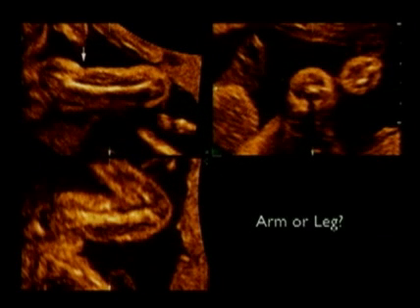Sometimes it's confusing to know whether the limb is an arm or a leg, but if you look carefully, you can see not only the features such as the elbow, the shoulder, and the chest, sometimes the ribs. There's also a line of demarcation where the deltoid muscle is attached to the upper arm, and you won't see this little notch on a leg.